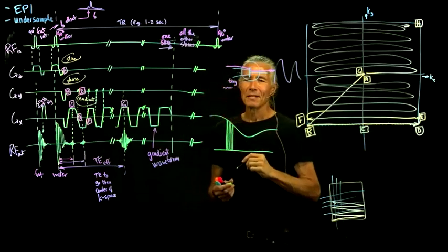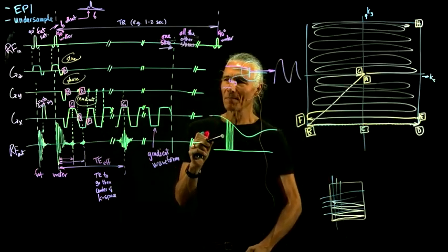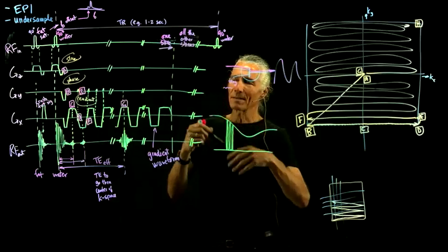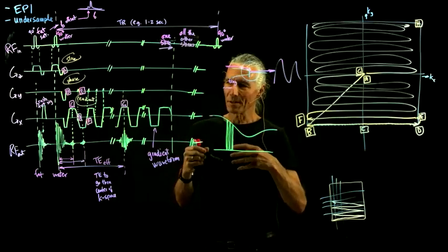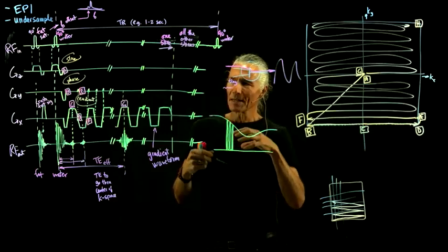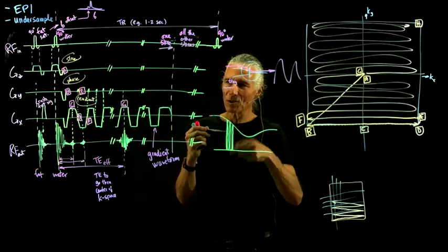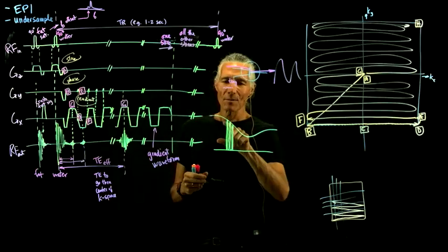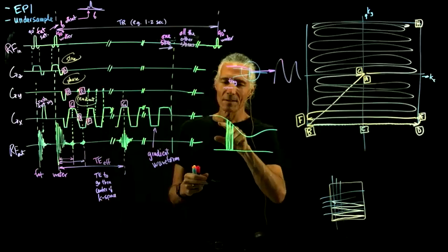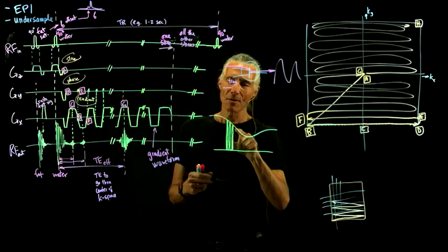So that seems like that wouldn't be a good way to make a nice smooth curve, but it turns out because of the inductance in the coil, which is basically effects on current that are due to magnetic fields generated by the current going through the coil when you change it, that will actually smooth out the output gradient waveform.